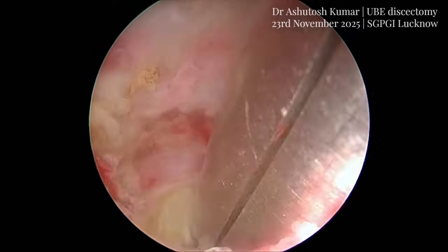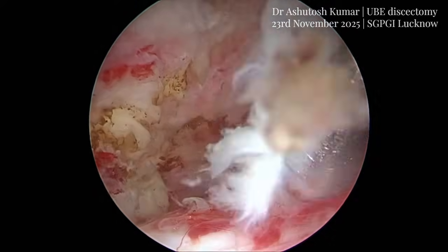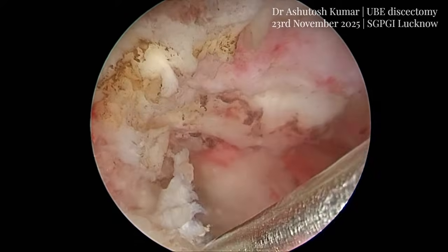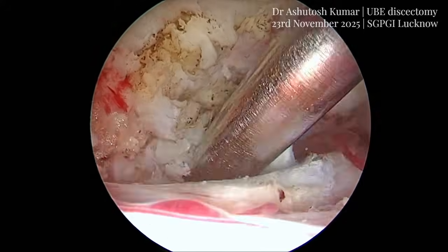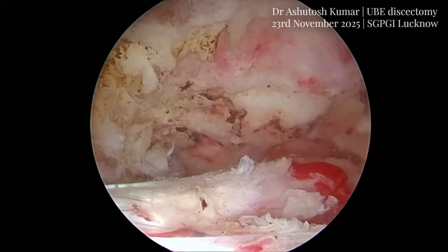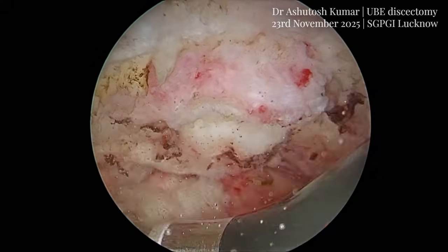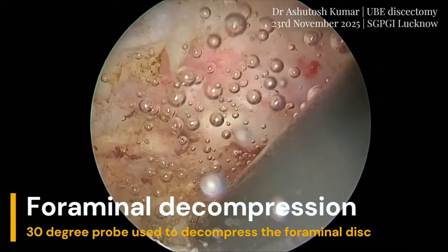It not only allows removal of the herniated fragment, but it also allows a good decompression of the disc space under the annulus fibrosus, thus confirming a complete decompression. Once adequate intradiscal space was created, the contralateral foramina could be decompressed through an inside-out approach.